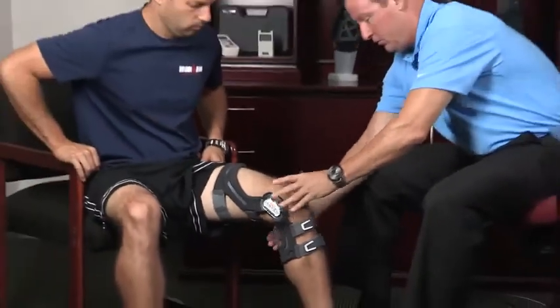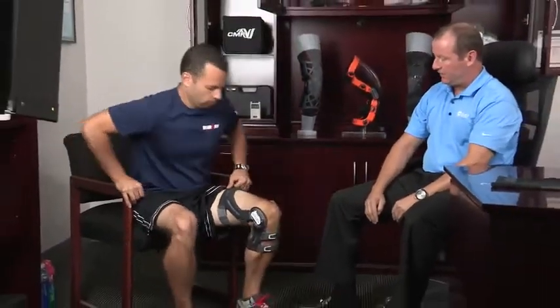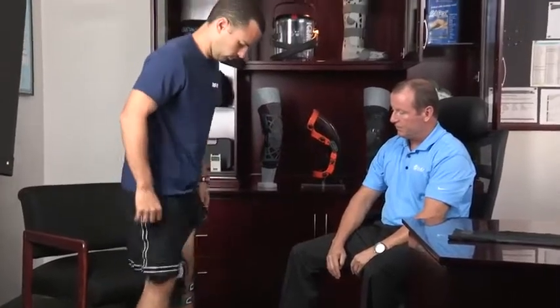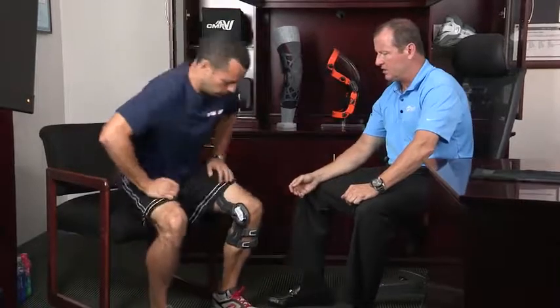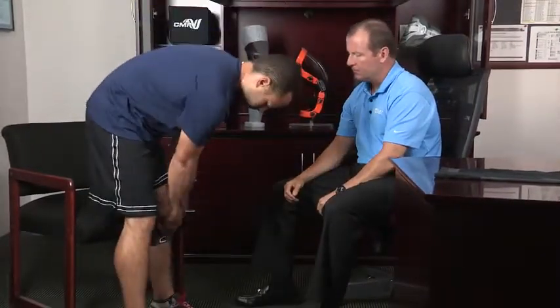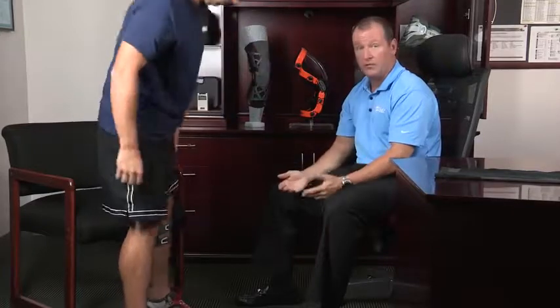So why don't we stand up there for a quick second and see how that fits. Feels good. Now that we've got the straps put on, go ahead and stand up, Nick, and you can kind of test the straps to see if they feel tight enough. Because one of the things you'll find is that if the straps are too loose, the brace might move down — what we call migration. So it's always good to get them tight enough so the brace is staying in place.